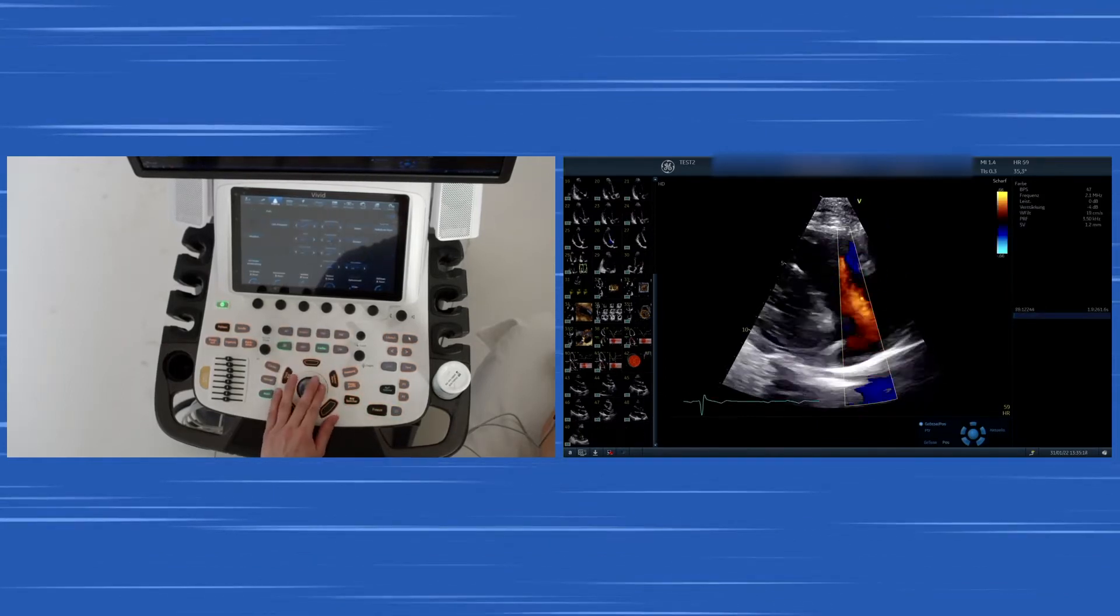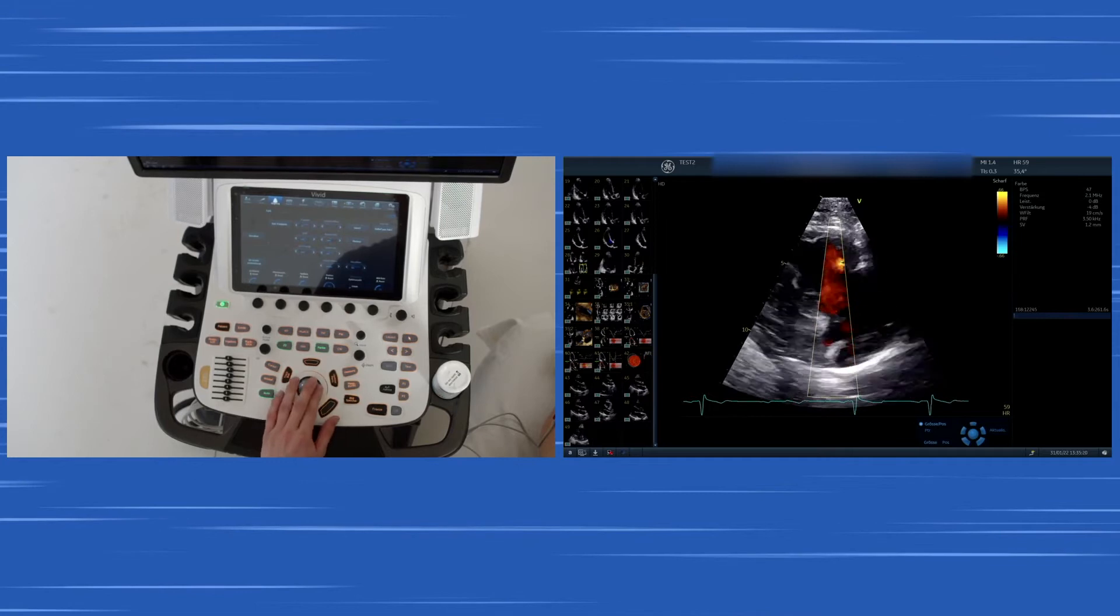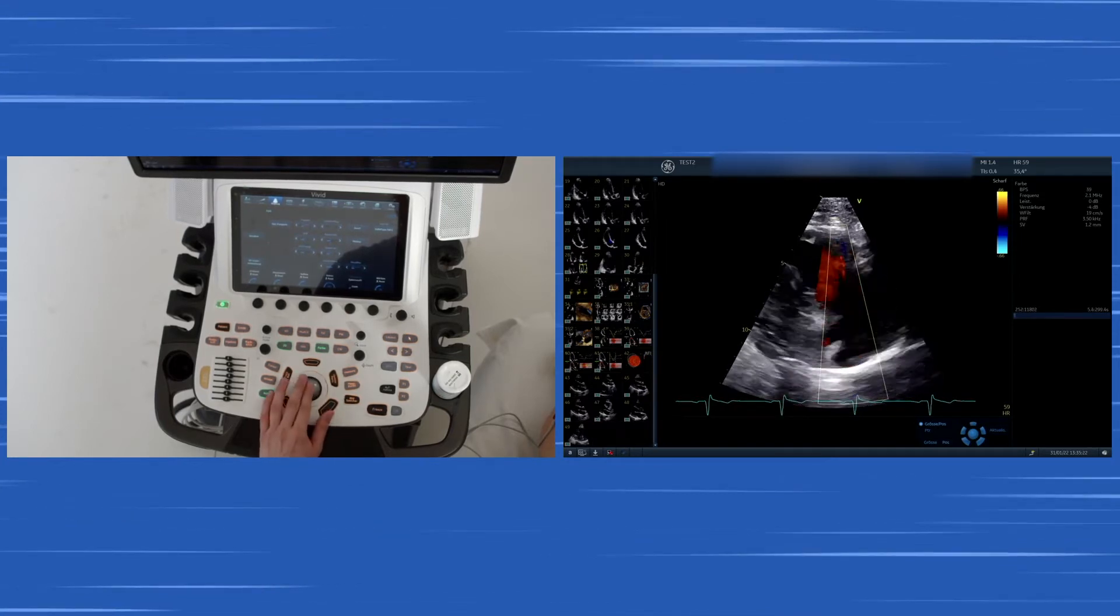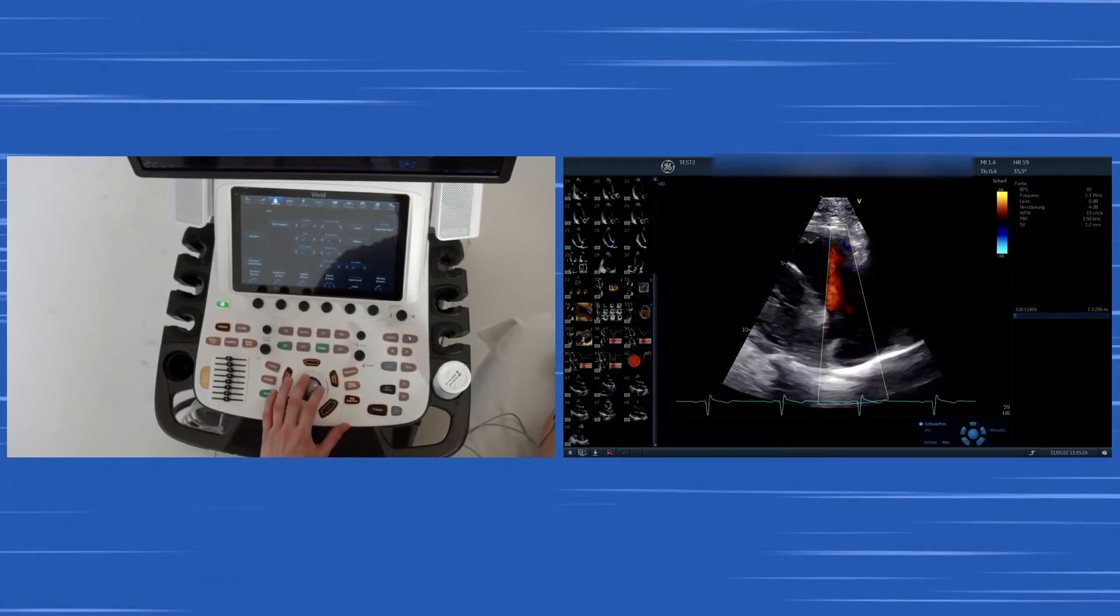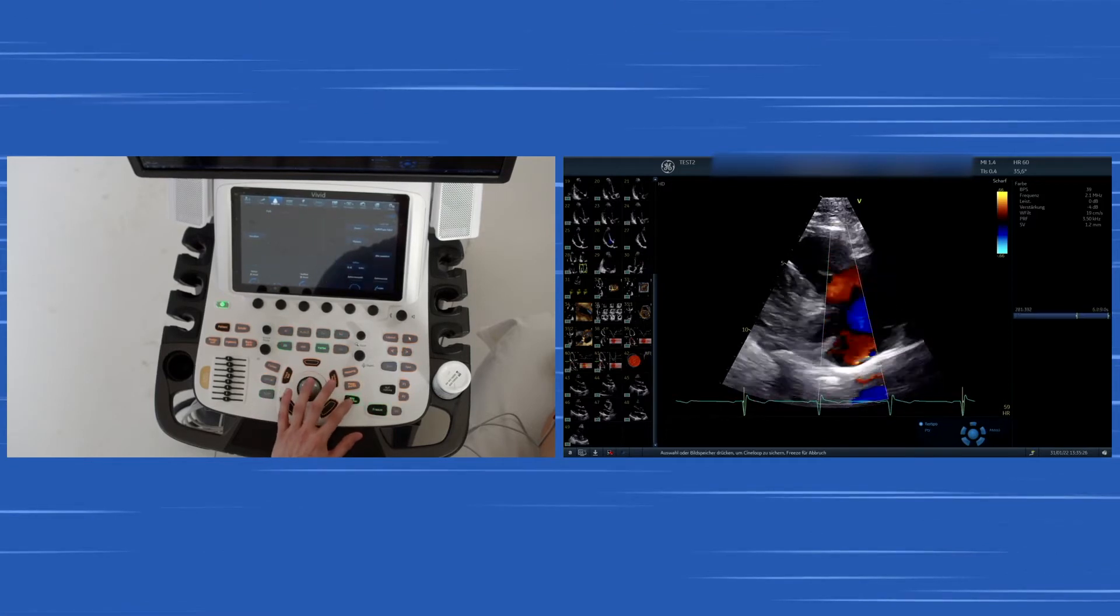You also can adapt the color Doppler and the region of interest there. The broader it is, the less frame rate you will have but the more information you will get, but keep it as slim as possible.